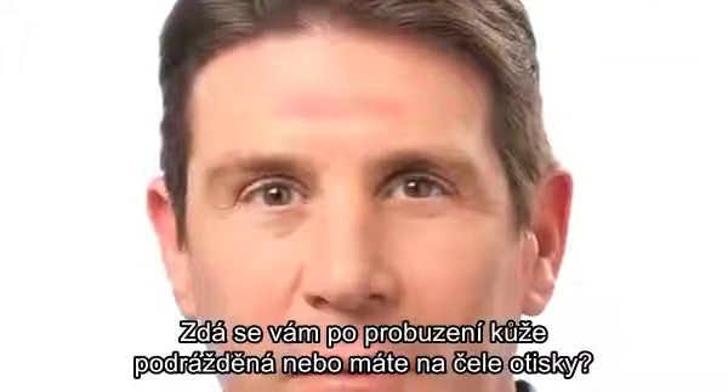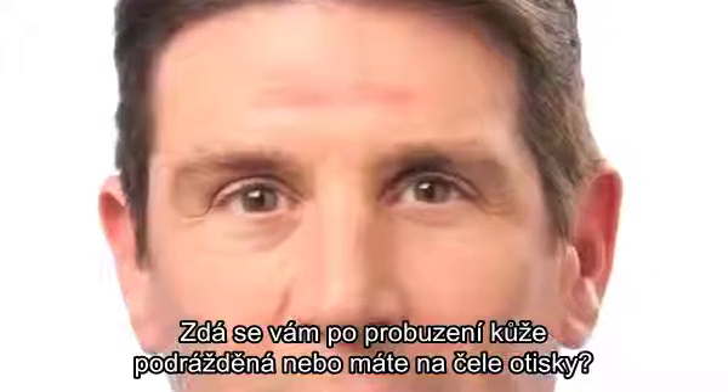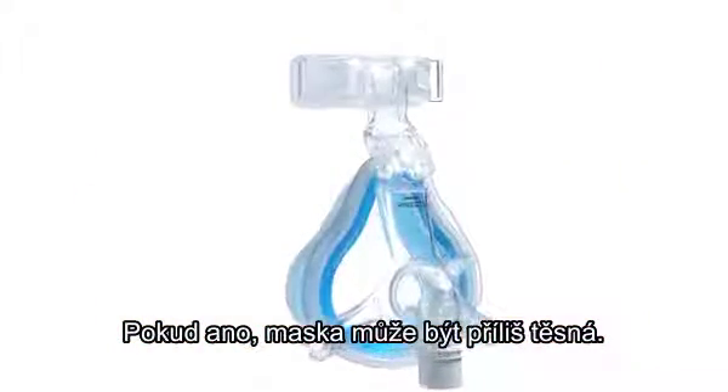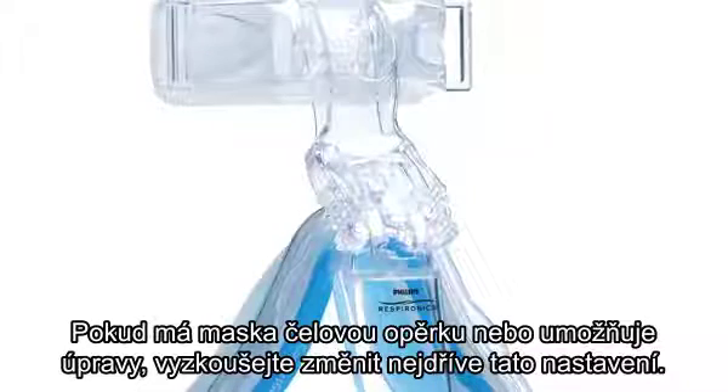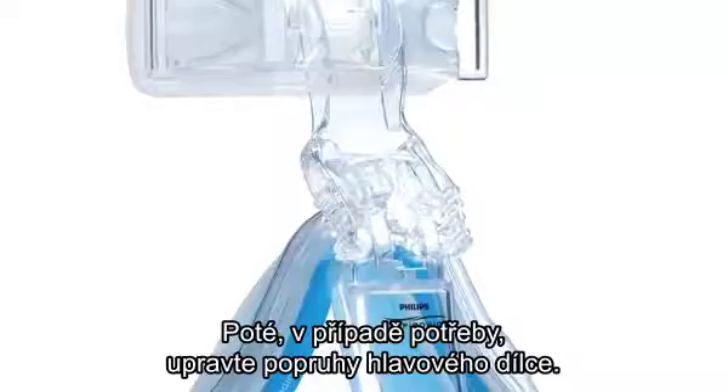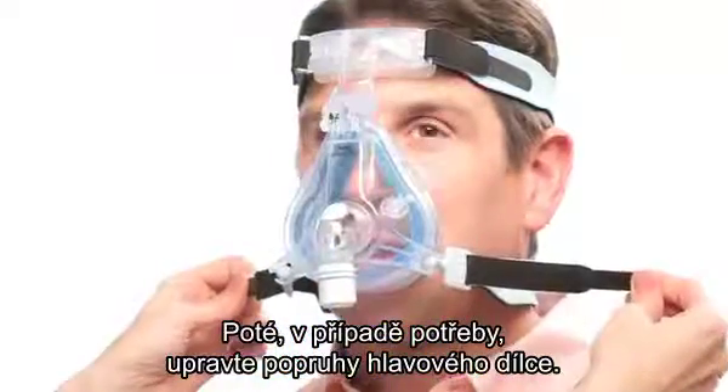When you wake up, does your skin seem irritated or do you have marks on your forehead? If so, your mask may be too tight. If your mask has a forehead arm or adjustment feature, try changing that first. Then, if necessary, readjust the headgear straps.